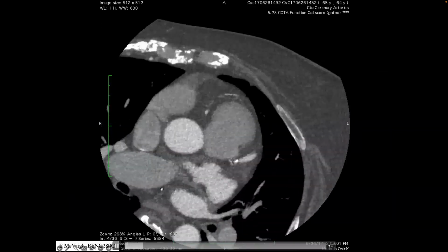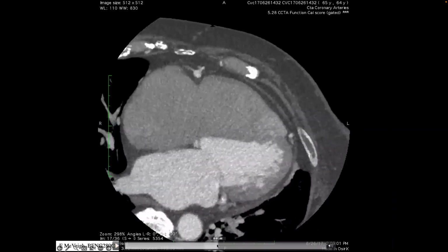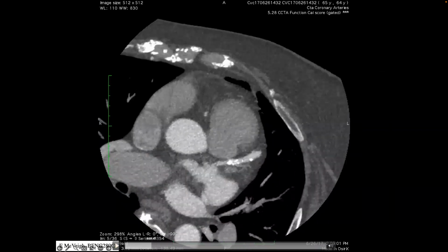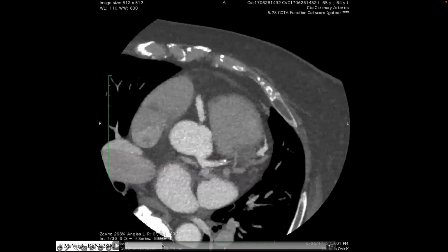And here's another example, just a random study pulled off the scanner. There's nothing special about this scan. But you can see the clarity with which these tiny little calcium granules in the coronary artery are visualized. That's a pretty small thing, and it's got a pretty sharp edge, to determine where it is and how big it is.